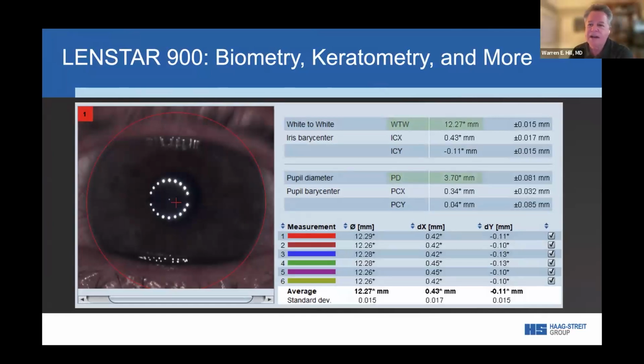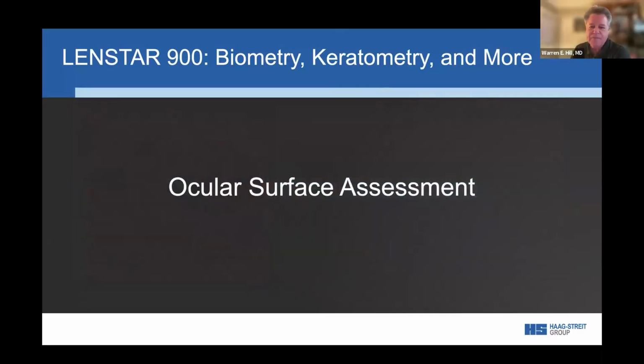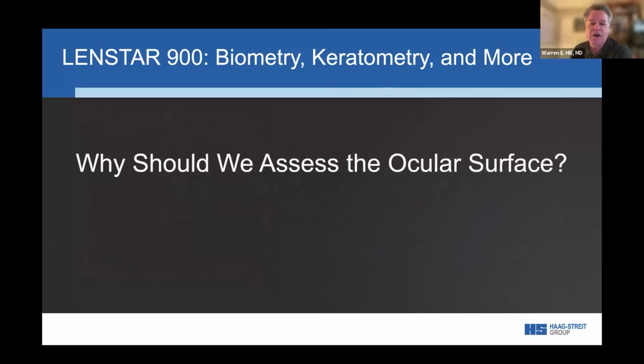And actually, this is my eye. I did this a few days ago just to see how accurate it was. Every one of the measurements has validation criteria and standard deviations that we can use to make sure that the measurements are correct. Now, because we have about 30% more measurement points, we can leverage this to give us an idea how good the measurements are.